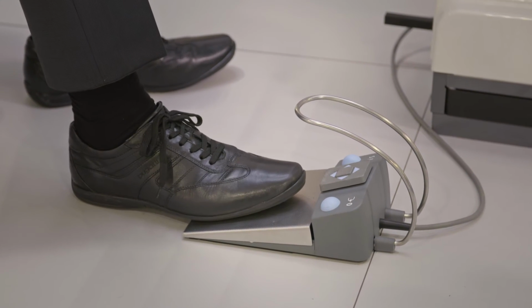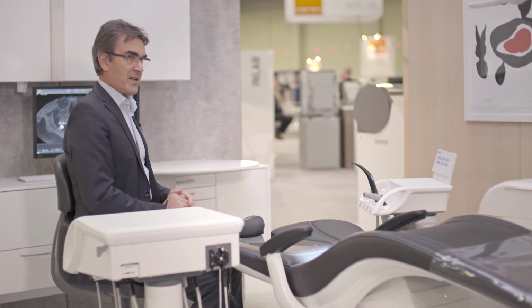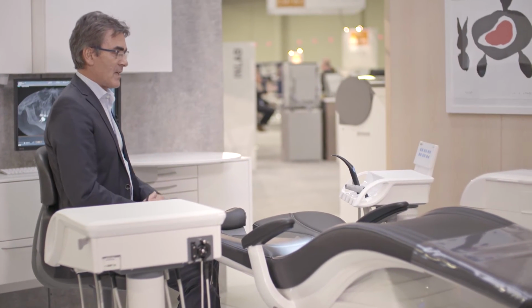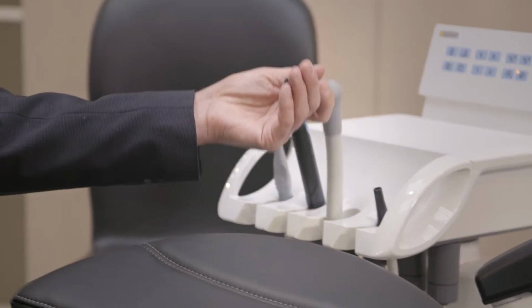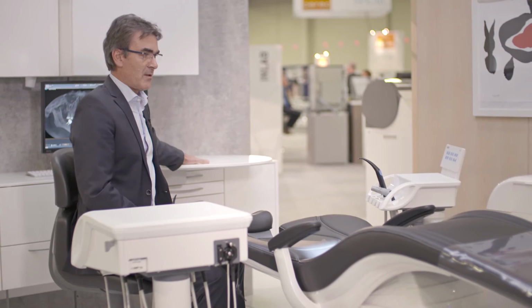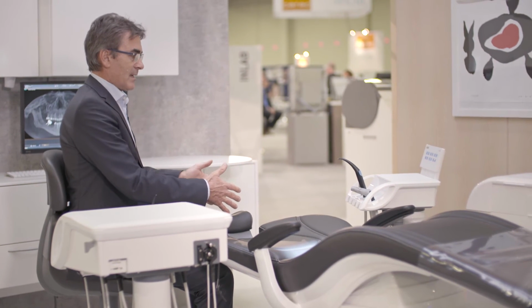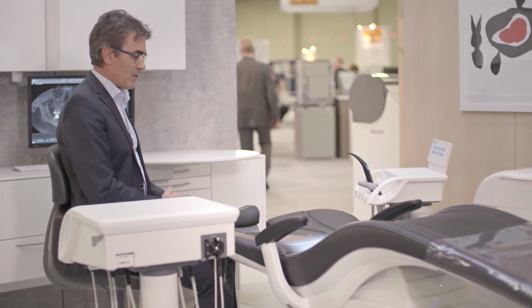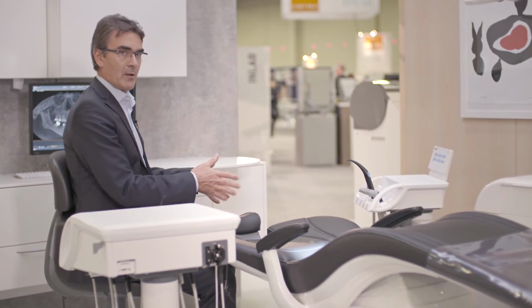What we love in Germany is that we have a split way for the assistant to work. She's sitting and facing directly toward the patient, and with her left hand she takes the suction system directly to the mouth, so there's no turning around. And with her right hand she can support me with the material from over here. So the assistant can help me with a maximum of her two sides, and it's easy for her to address the patient directly without twisting her body. That means for both of us we have a very upright and ergonomic positioning.